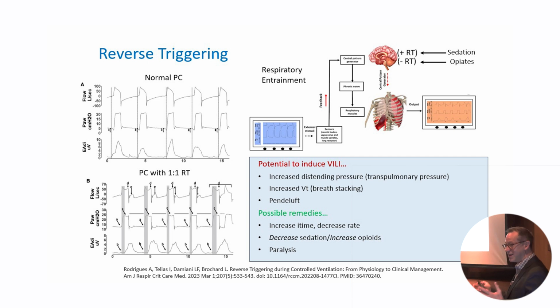And it's sort of vague, but if you bear with me, basically it says that the ventilator delivering this breath causes a stimulus to the chest wall muscles and the diaphragm muscle and the lung stretch receptors, and that somehow impacts this central pattern generator region of the brain to put out a pattern respiration rate that happens to exactly match the ventilator rate of the input. And so you can see reverse triggering in a 1-to-1, you can see it in a 2-to-1 or a 3-to-1 pattern, and sometimes it's even random, but it usually has some sort of relationship to the ventilator rate.